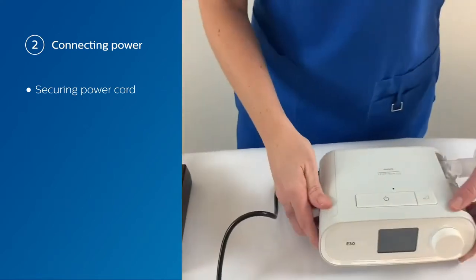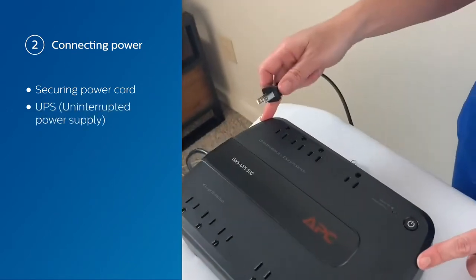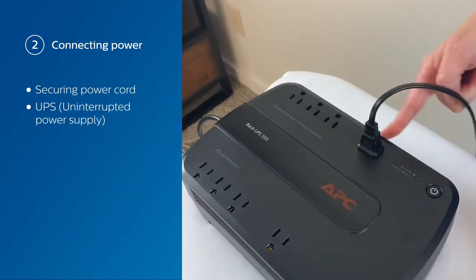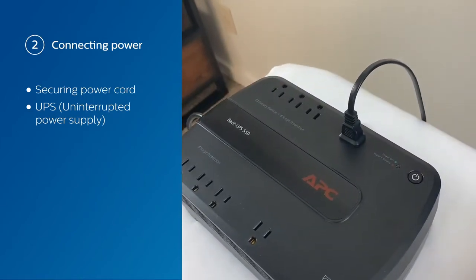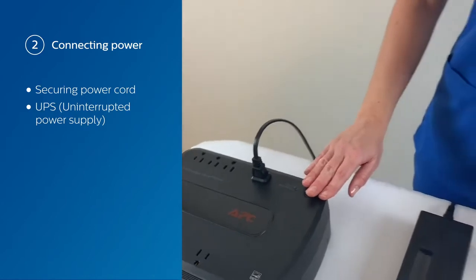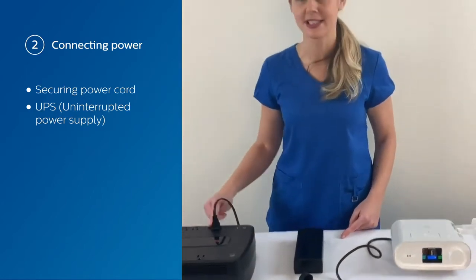Flip the device back over, take your AC power cord and connect that to your backup UPS — uninterrupted power supply. Ensure to plug it in the back row as these are connected to the backup battery. Then plug in the UPS to the wall and ensure the power is on. You want to ensure that the UPS and the device are at least two meters apart and that there's no other equipment connected to the UPS.